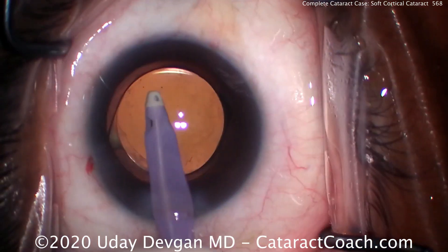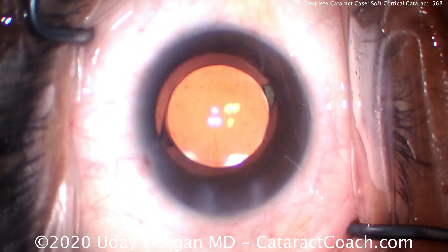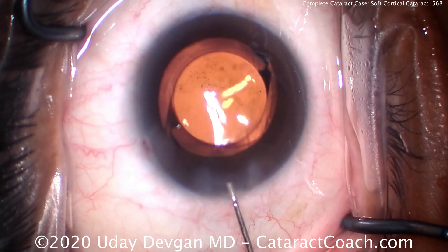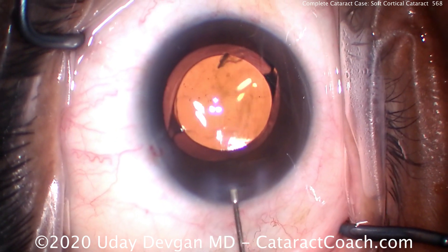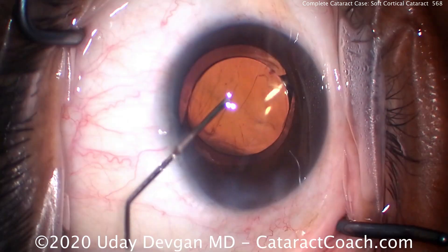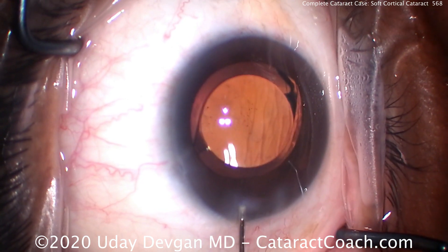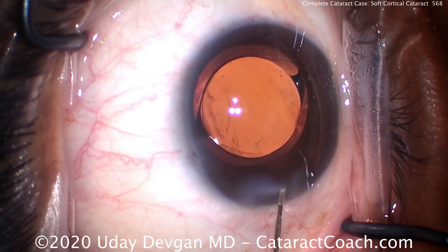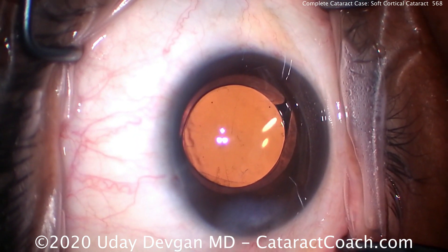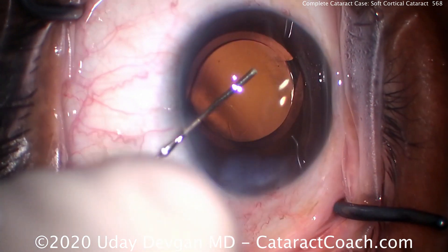We can see a beautiful centration of the lens with good overlap with the capsulorhexis. That looks great. We'll seal up the incision — otherwise a routine case, and you should be able to master this one quite early in the learning curve. There's a small piece of lens fragment still in the anterior chamber — let's wash that away and get it out. Use this cannula with balanced salt solution to seal the incision, but also to sweep the anterior segment to make sure there are no retained lens fragments and no residual viscoelastic in the eye.